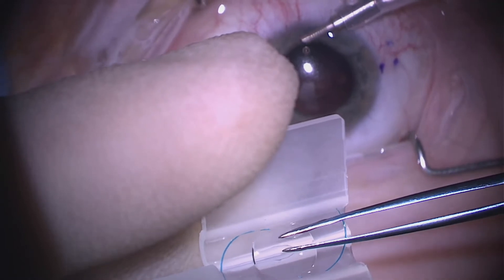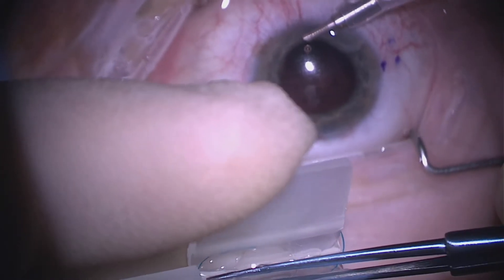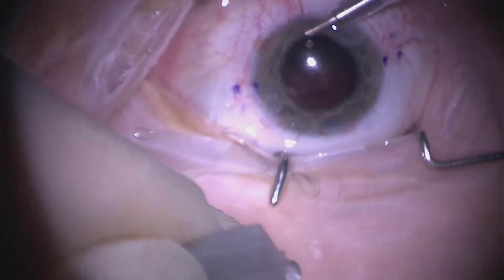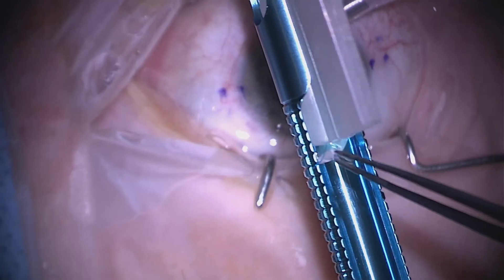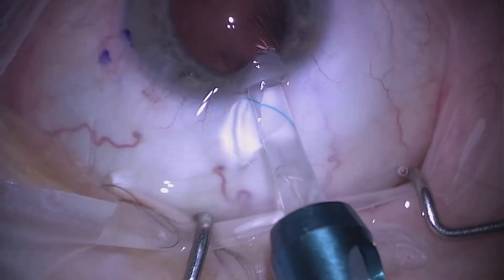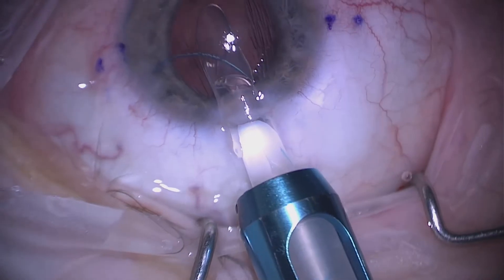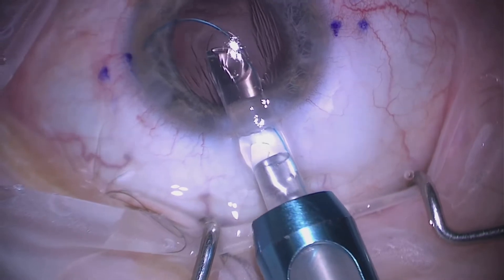We place the lens into our injector and fold it carefully, being careful not to snag the haptics as these can sometimes be amputated if due care and attention is not taken. We put it into the Emerald injector cartridge and then inject the lens into the anterior chamber carefully, onto the surface of the iris.